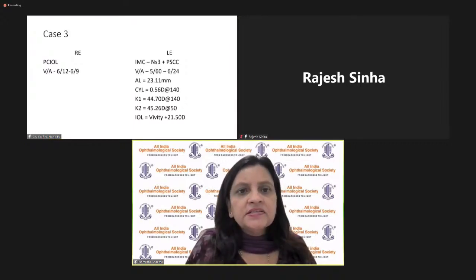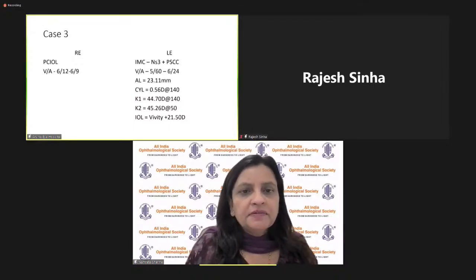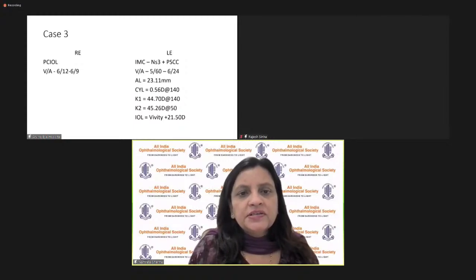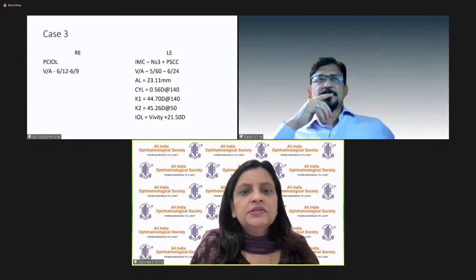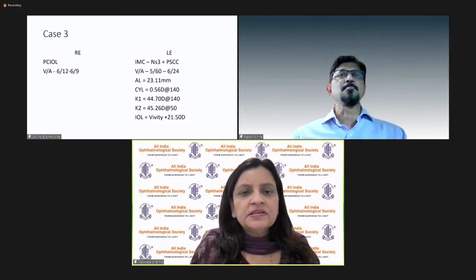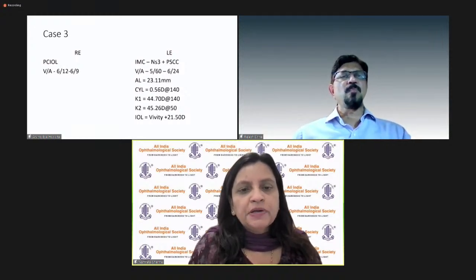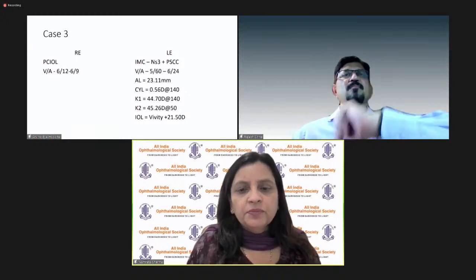So the next case is again an immature cataract. It has a posterior subcapsular cataract, and visual acuity is 6/24, axial length is 23.11, with a cylinder of 0.56, K1 44.7 and K2 45.2. So we are going to be having an implantation of Vivity intraocular lens, 21.5 diopters.